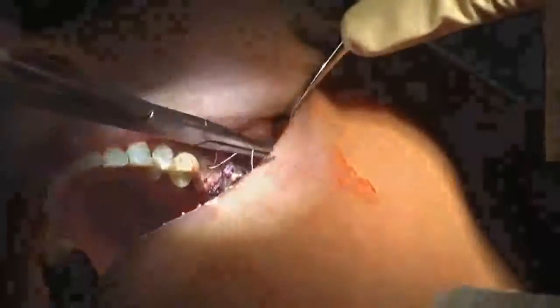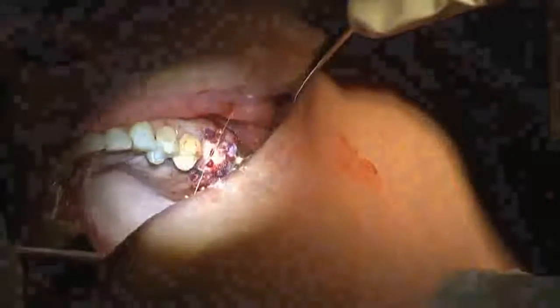I go in through the top of the socket seal, out the buccal gingiva, bring the suture around, go in through the top of the socket seal, out the lingual gingiva, and then I just tie it.